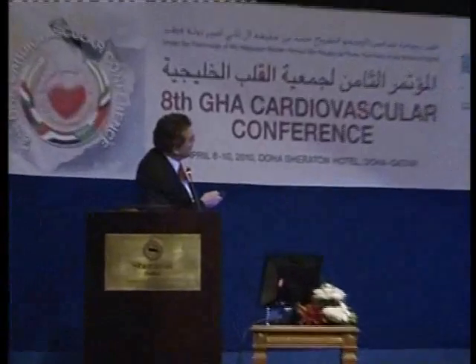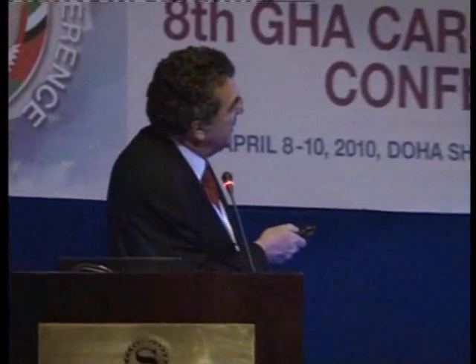And this is the circumflex. You see, in this view, it was around 50 to 60%. In the diagonal, we have 1 lesion here, 1 lesion here, and the critical lesion of the LAD. So it's 0, 1, 1? It's certainly 0 and 1. There is a plaque at proximal, but we could consider that.